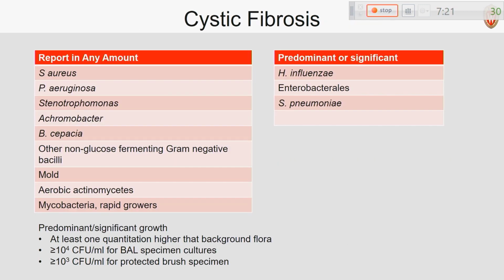So, like I said, I'll ask for feedback on this one. Is there anybody that consistently works up cystic fibrosis patient cultures? Children's? You want to make any comments on them, the difficulty of them, what you do with them?